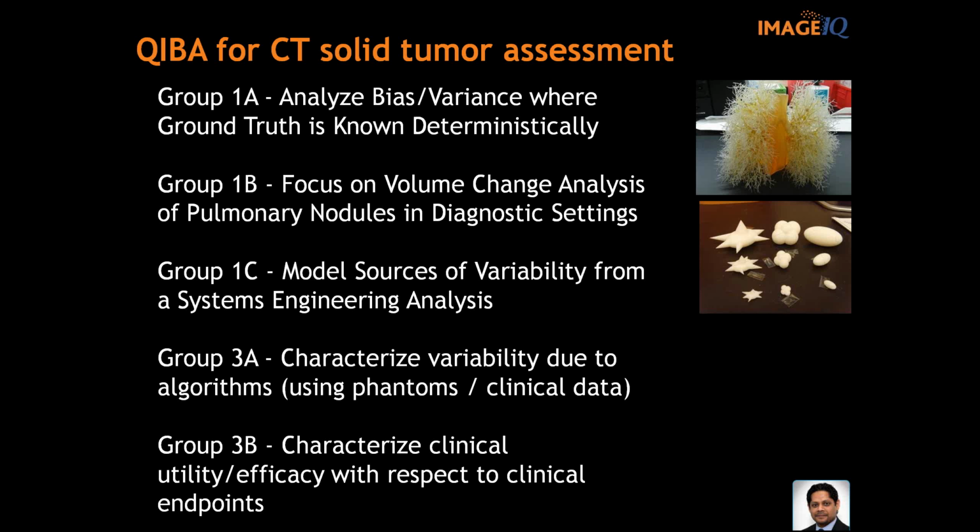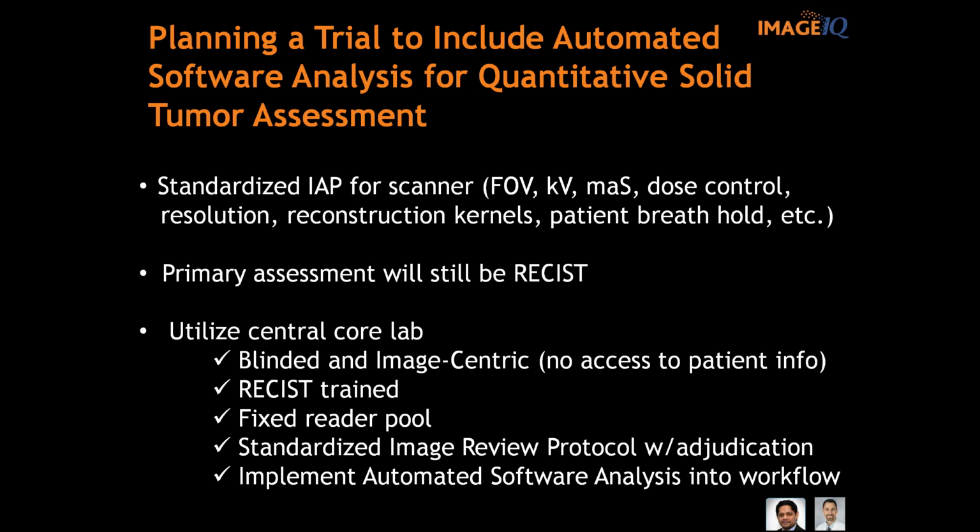And so at ImageIQ, we use a physicist to actually look at these scans to make sure that they're within a specific signal to noise and field of view is correct, so that when they're applying these protocols the next time, they have them in place, right? And so the next technician that sees the protocol knows exactly what to do. Also understand that until the software goes through qualification and is a more accepted way of doing the analysis, RECIST is probably going to be the primary assessment, right? I wouldn't fall back on software as the actual way as a primary or secondary endpoint output.